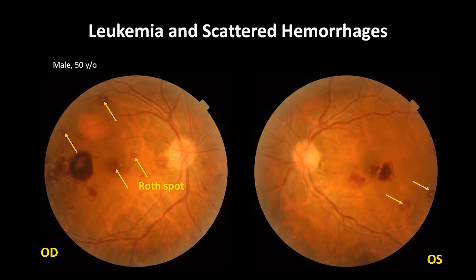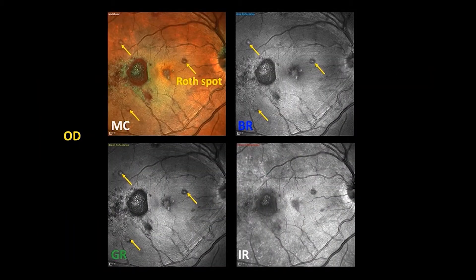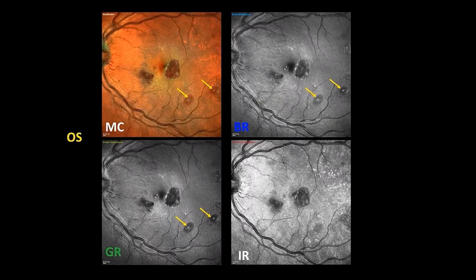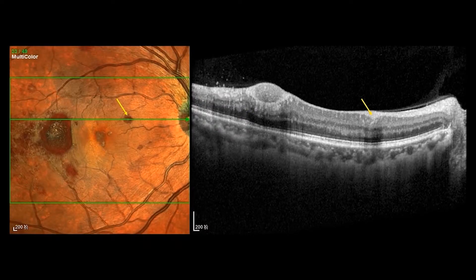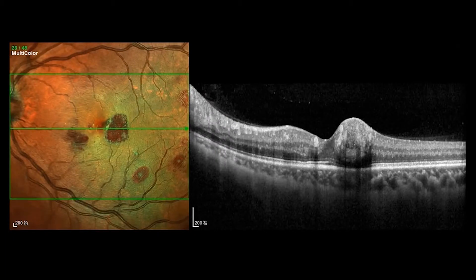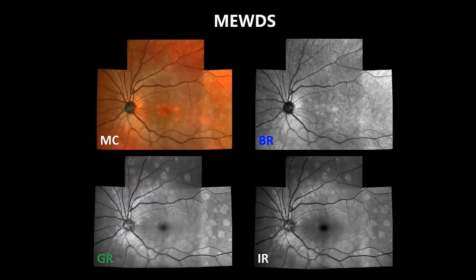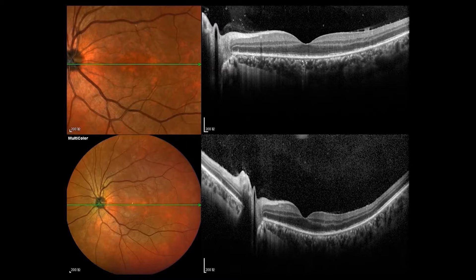This patient had leukemia. We saw scattered hemorrhages on his fundus with Roth spots on color fundus photo. Scattered hemorrhages and Roth spots also showed clearly on multicolor, blue reflectance, and green reflectance. The Roth spot corresponds to a localized hyperreflective region in the retinal nerve fiber layer. We also see the macular hemorrhages. For MacTel patient, multicolor has its advantage to reveal those dotted lesions. Combining with OCT, we can see the interrupted ellipsoid zone.